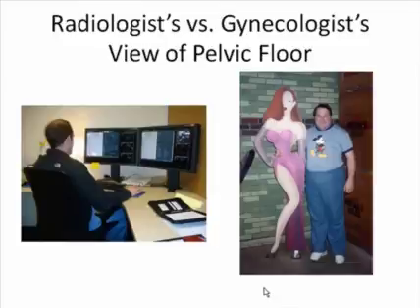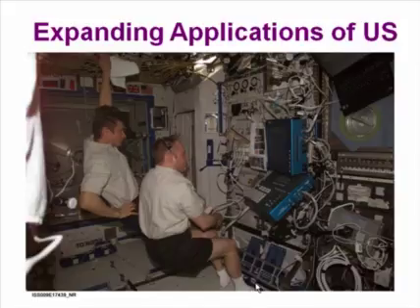There's a big difference between the imager and the clinician in evaluating pelvic floor disorders. The clinician, of course, has a good idea of the clinical problem and the surgical approach to those problems. The imager is just beginning to understand what anatomic factors are important.